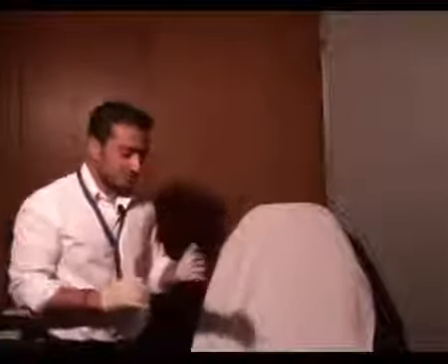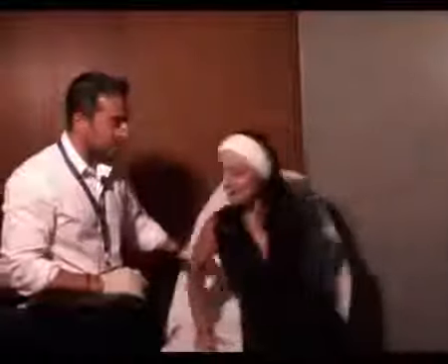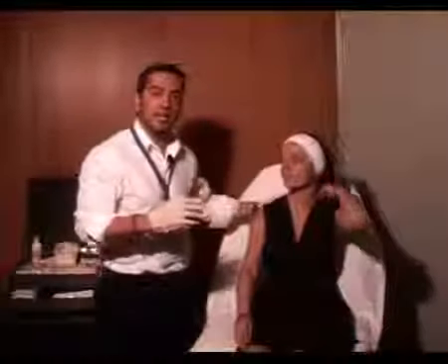All right, so I'm going to start. I'm going to call in my first volunteer, so please. Okay, let's have a seat. If anybody has any questions, they can actually ask me while I'm injecting. I have no problems doing that.